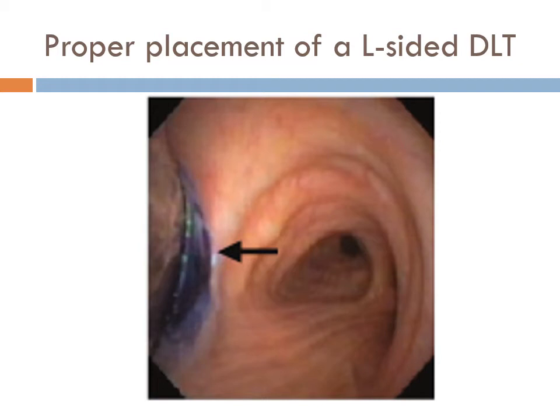Again, you're going to go in and look after you go up to 100%, put both lungs up if it's an emergency. If it's not an emergency, but you just want to problem solve, I'd still go up to 100%. I wouldn't go to two lung ventilation if I feel confident I can go in, because you now go in through the viewing ports right here, or the suction ports, or the exhaust ports. These do a lot of different things.